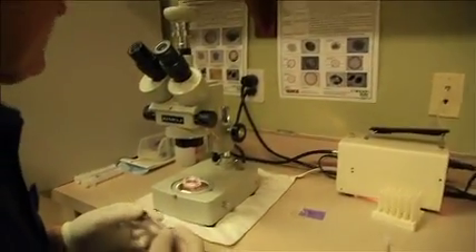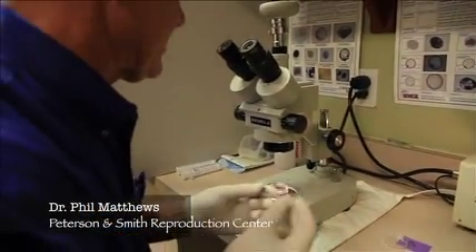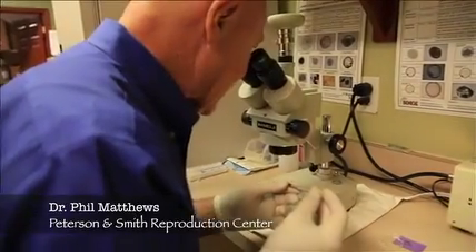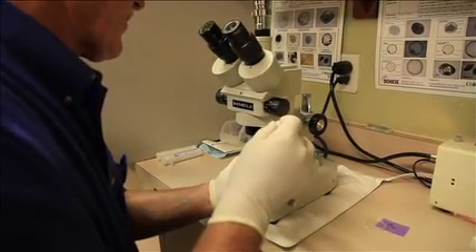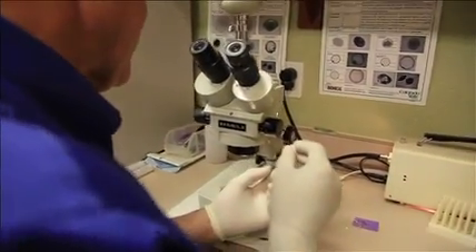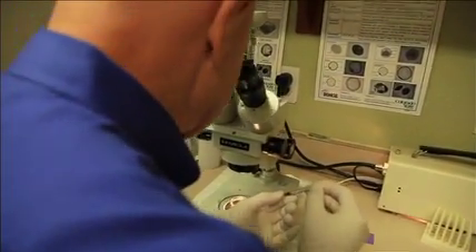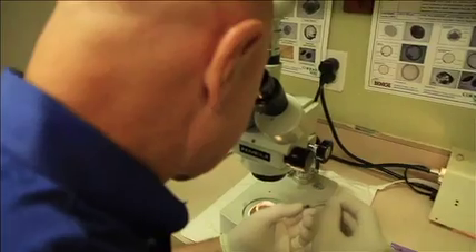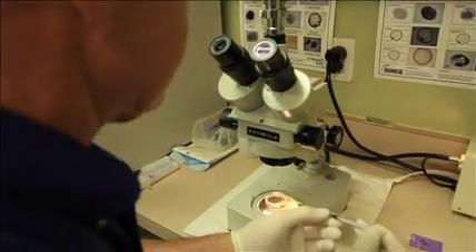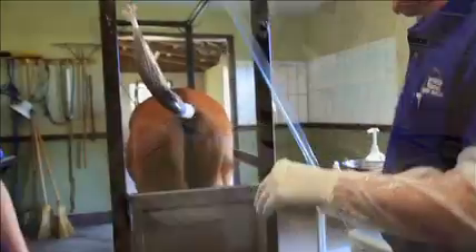My dish has been put back on the microscope. I've located my embryo — I look again, yep, it's still there in that same position. I'm going to go over here, retrieve enough fluid to fill half my straw, pull up a small column of air, go back in and pick up my embryo, another small column of air, and then fill the straw the rest of the way.